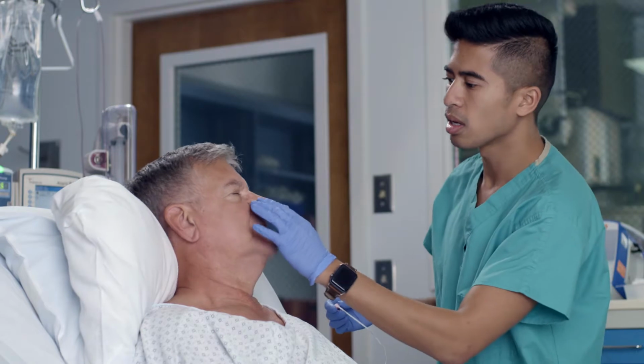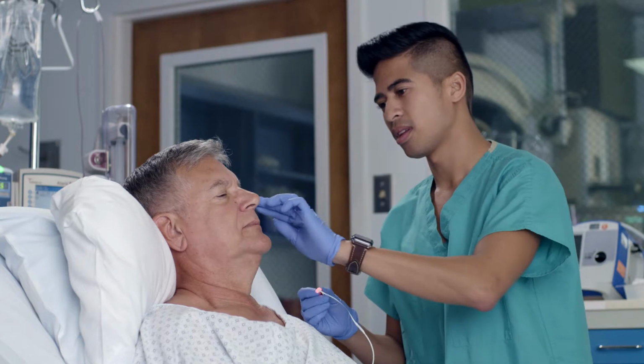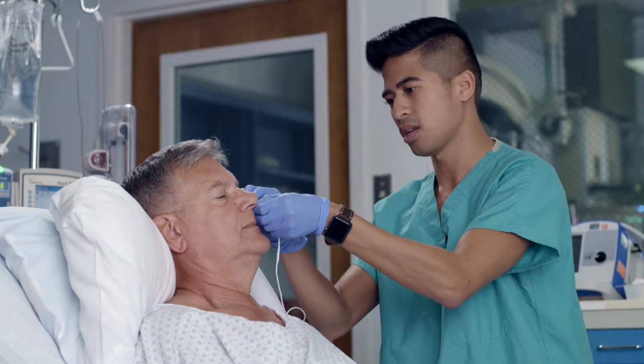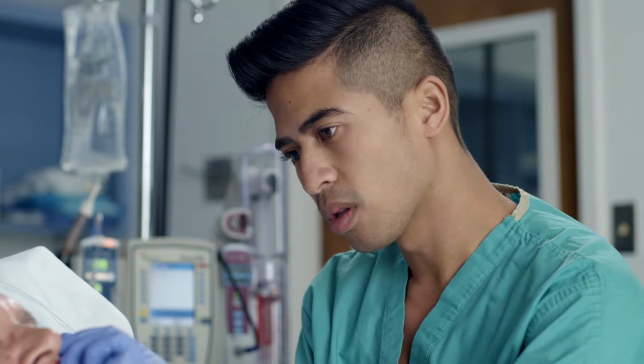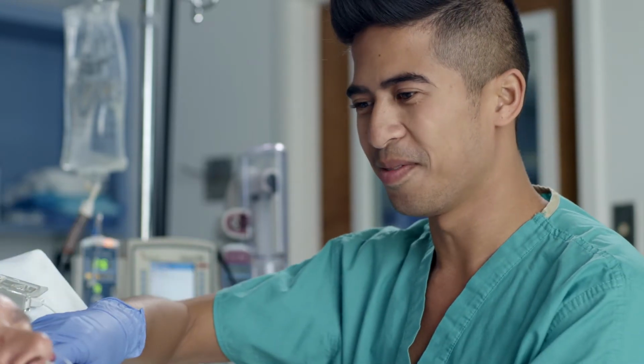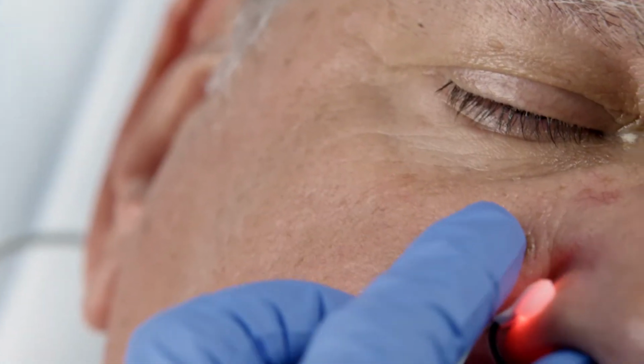The sensor can also support a more vigilant protocol to further protect high-risk patients' skin integrity. For patients deemed high risk, including patients on vasopressors, external cardiac assist devices, and previous or high potential for skin breakdown, alternate ala every 4 hours and check the site at 2 hours. These recommendations should be understood as the minimum check-rotate guidelines and can be modified to further support your workflow and/or specific patient population. When checking the site or reapplying, simply place your thumb under the sensor and finger on the outside pad, gently sliding the sensor off the ala.